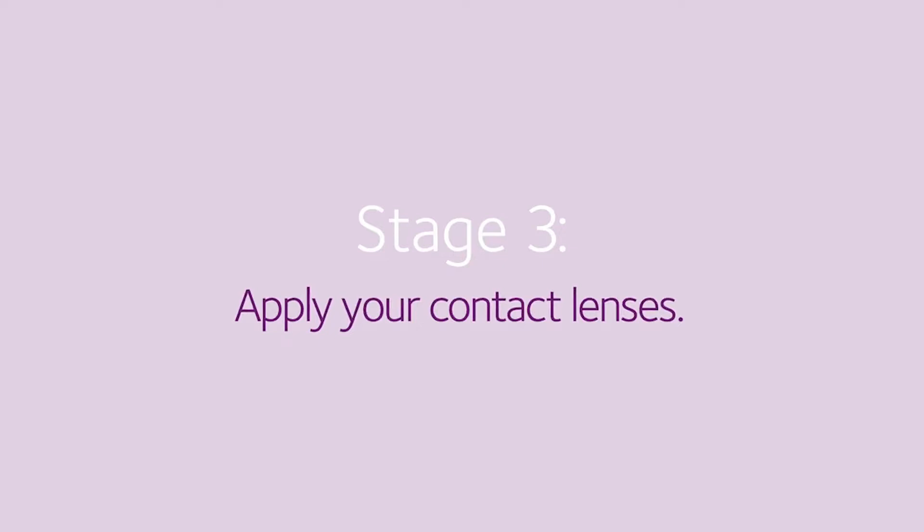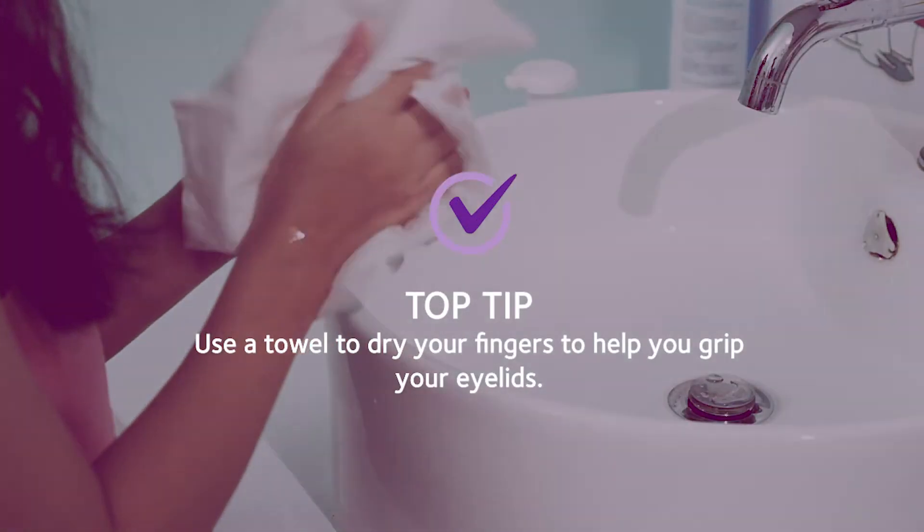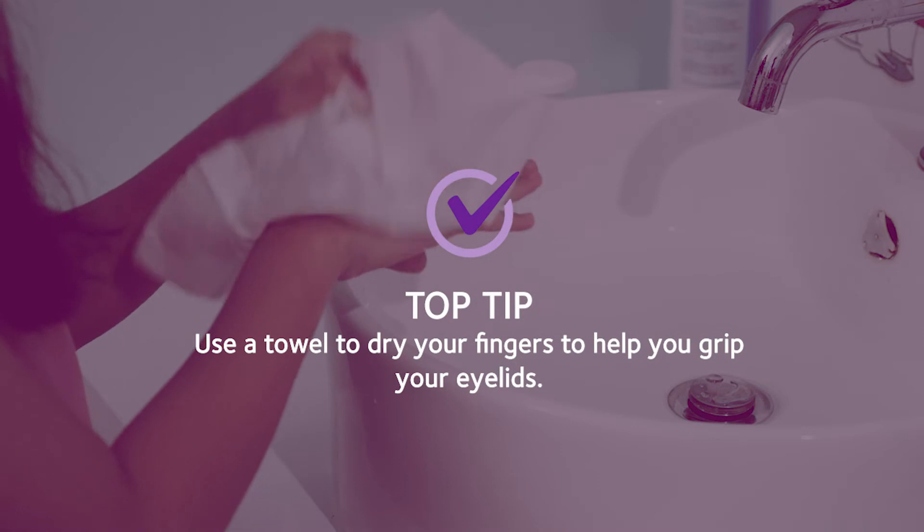The next step can take a little time to master, because it's completely normal for you to blink when something goes near your eyes. Don't worry — just take your time. Use your towel to dry your fingers to help you grip your eyelids.